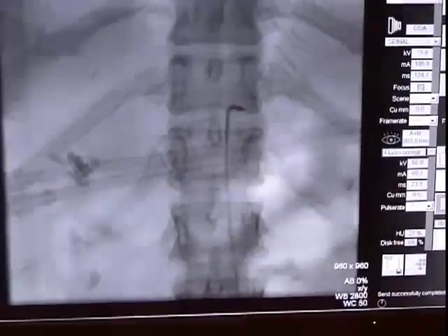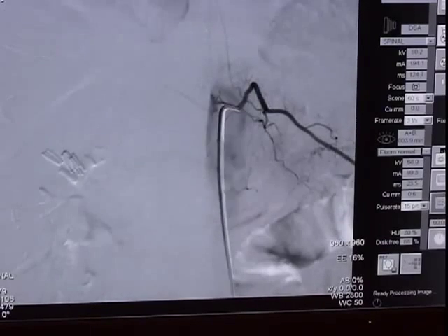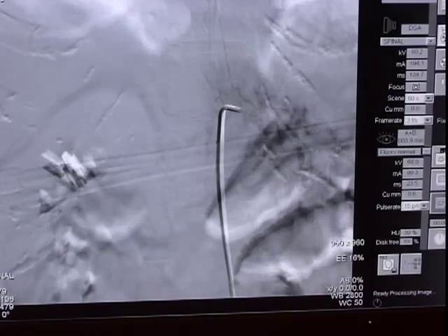Here the catheter has been advanced and placed into a radicular artery. Of note, one also sees the anterior spinal artery being supplied off of this vessel to the spinal cord. An injection is carried out, and the image is saved for later review.